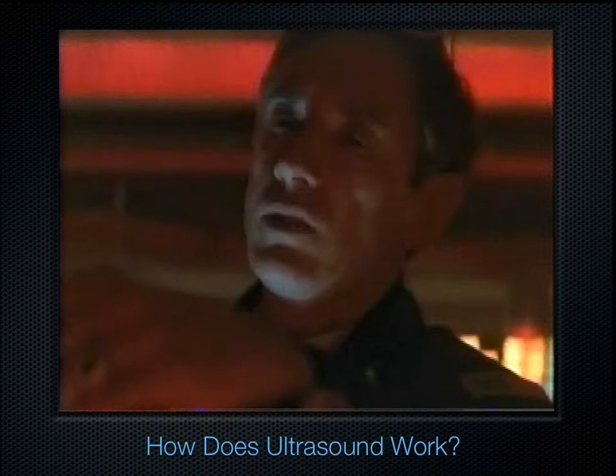The way that works is, because you know how fast sound travels in water, all you do is listen for the time of flight it takes that ping to go out and come back, and therefore you can calculate distance. And ultrasound works exactly the same way. We know how fast sound travels in soft tissue, and the ultrasound machine releases the pulse. It goes into the body's tissue and then returns, and depending on how long it took the sound to come back, it plots a dot on the screen in terms of depth. So the longer it takes the sound to come back, the further down the screen the ultrasound machine will plot that dot.